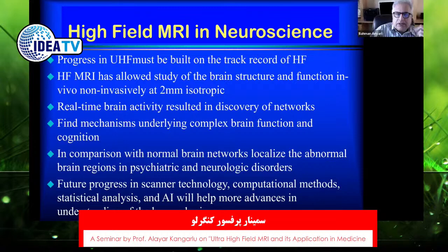Are there any other questions? Okay, so maybe I can ask one last question, Alayar. This is in relation to the contrast agent and brain tumor, and in particular for image-guided resection. The washout time of the contrast agent, in relation to the actual surgical time that's needed, is that a constraint? And if so, what is the solution? Do you require multiple injections? How would that work? It is a constraint. Obviously, the washout rate is a question.